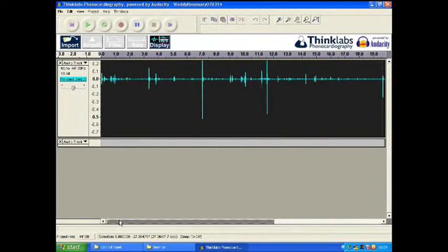So there we've got a first, second possible and a nice gap. Here we've got another sound, but nothing. This is insignificant, really. And then we've got an enormous one, really nothing. And then we've got two sounds, which could be a lub-dub together, or it could be a bundle branch block, with a split there and the same there. And then the small one, the second.